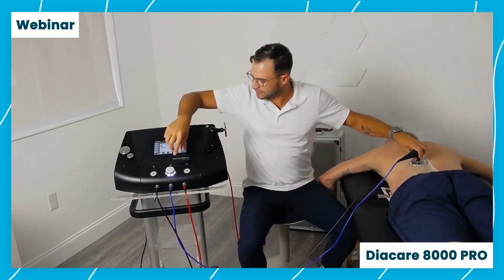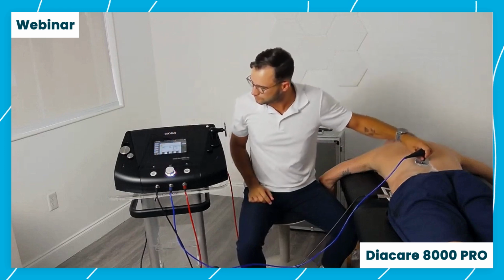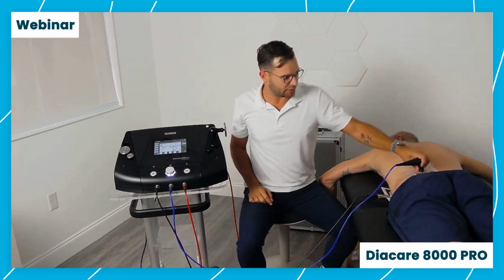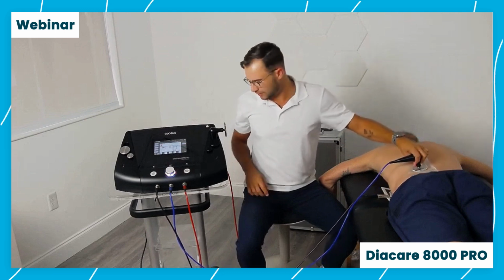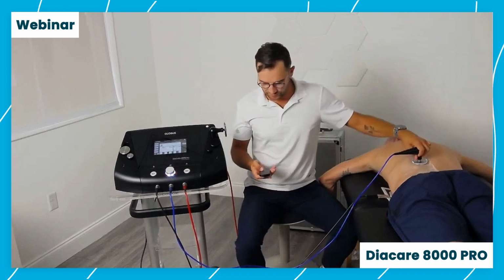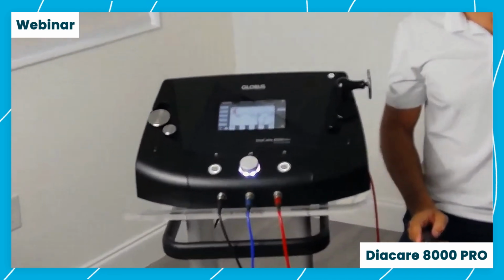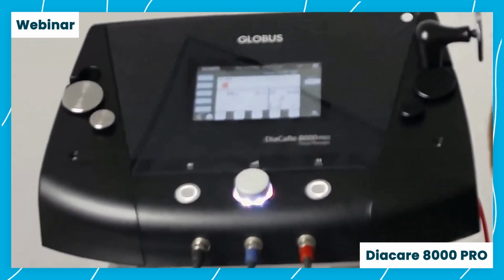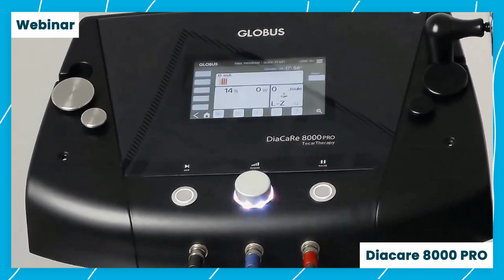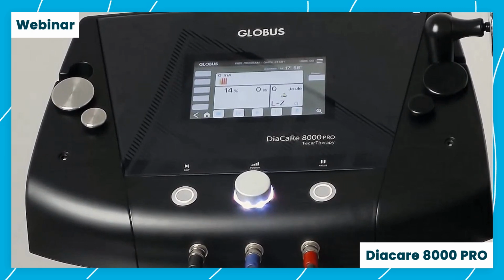Same way, we can see how much heat we're generating. And we're getting all the live stats directly on the machine here. I'll give you a little bit better of a look at the screen as we're finishing up. And you can see the graphic here of what's going on.